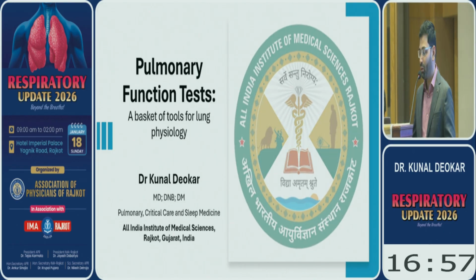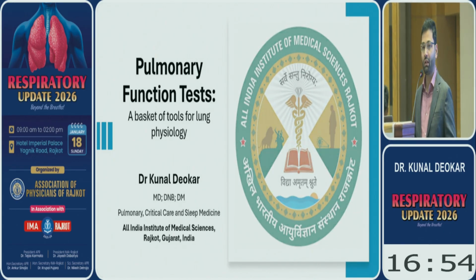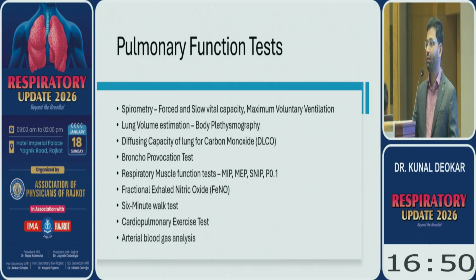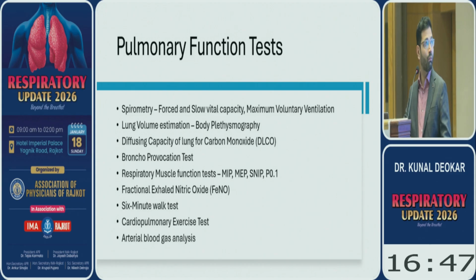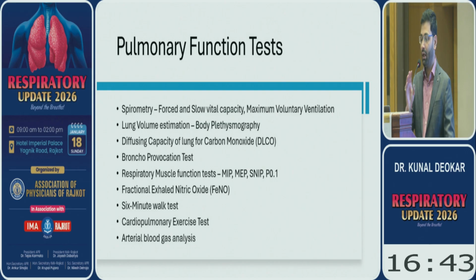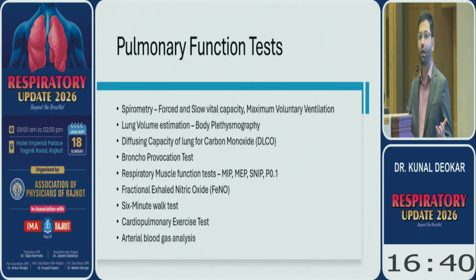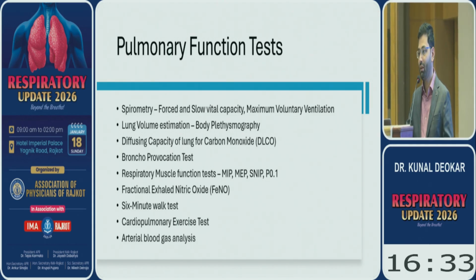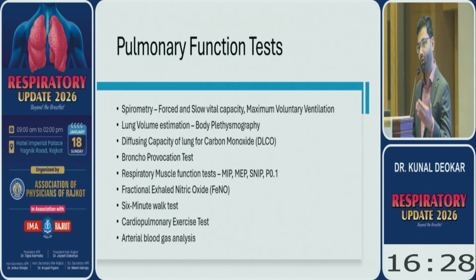So I have been told to talk on pulmonary function tests for the next 17 minutes. In most cases, spirometry is often equated with pulmonary function testing, but as you can see, it is not so, because apart from spirometry there is a whole gamut of tests which involve pulmonary function tests. To speak on all of this in 17 minutes would not be possible, so I can only give an overview of the tests listed here, not a comprehensive list, but a near complete list.